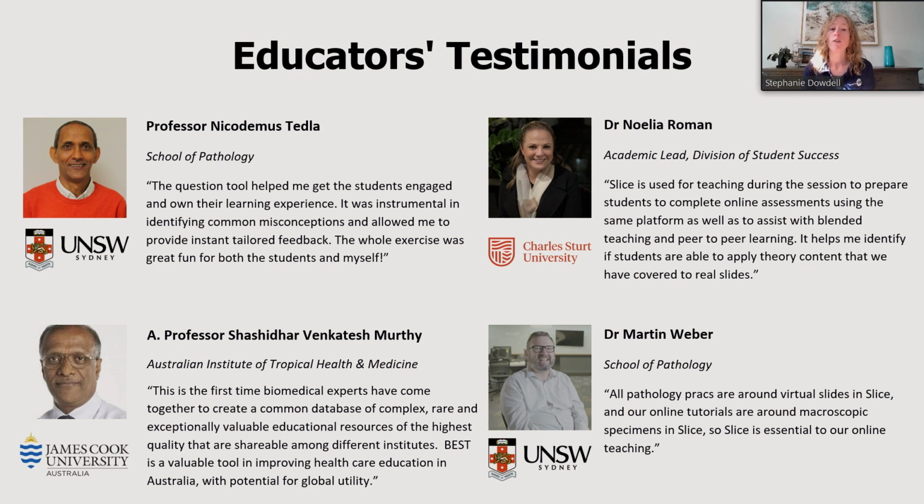Dr. Noelia Roman of Charles Sturt University, as part of her work with Slice in the classroom, supplemented face-to-face tutorials with physical microscopes. And in her weekly sessions using Slice, she was able to provide a blended teaching approach. The annotation tools helped her assess how students were applying theory content. Associate Professor Shashi Murthy from James Cook University was one of our first contributors to the image bank and contributed some rare examples of blood films.